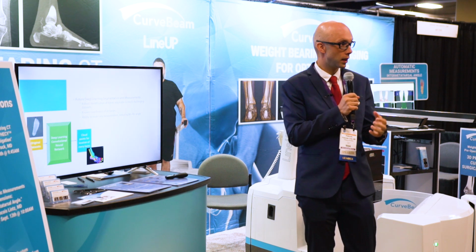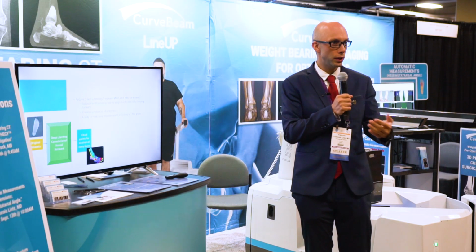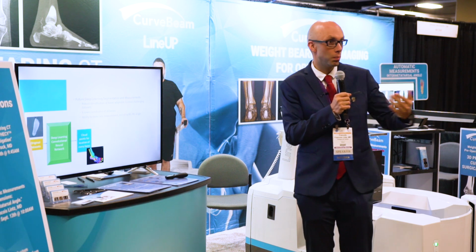I think this is key for the development of weight-bearing CT, because what holds us back a little bit is that we all have the intuition this is a great technology, but it gives us so much information that it takes time. And you have the patient with you in your office and you have to give him an answer. It takes you more time to analyze this 3D data. So this will really help us, because it will take the burden off us to have to think about how to measure in 3D. It will be done automatically.